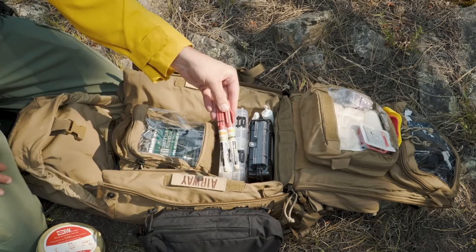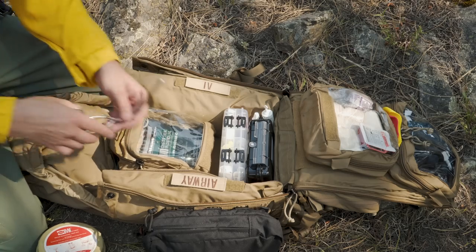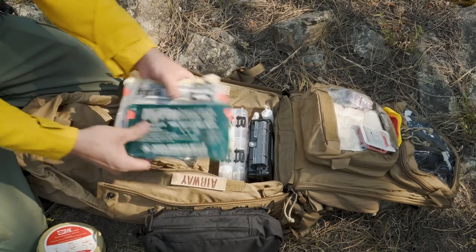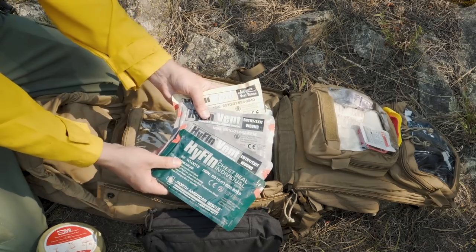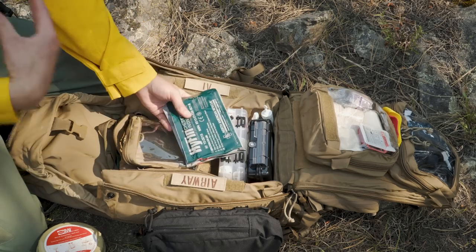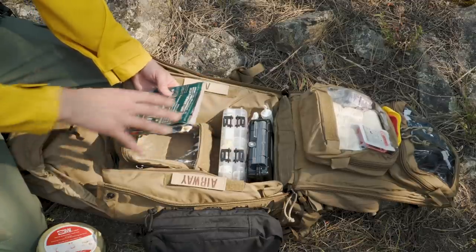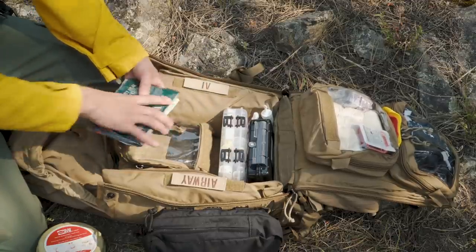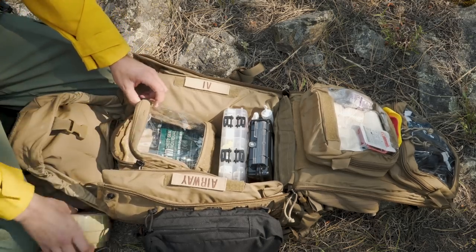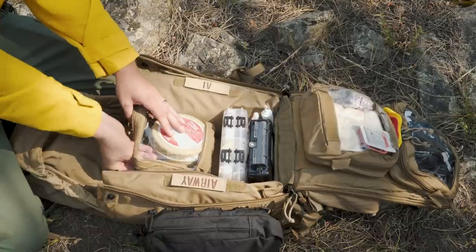I have two ARS needles for needle decompression of the chest if they have a tension pneumo, and then I have a pair of McGill forceps if somebody's choking. Last but not least I have a plethora of vented chest seals. These are my extras — most likely I'll use the one on my chest rig or on one of my vest IFACs. These can also be used for some abdominal wounds and other issues, so it's just good to have them and I keep them in the airway section.